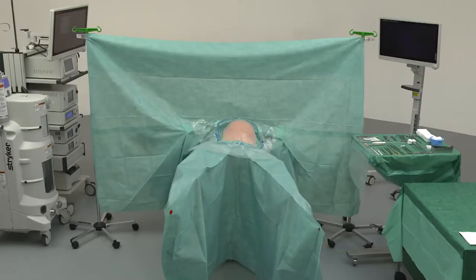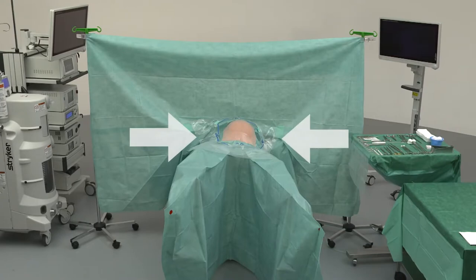The Sectio Set 2 also includes an absorbent and soft baby drape and an integrated armrest cover. This also provides an adequate sterile barrier when relocating an arm.